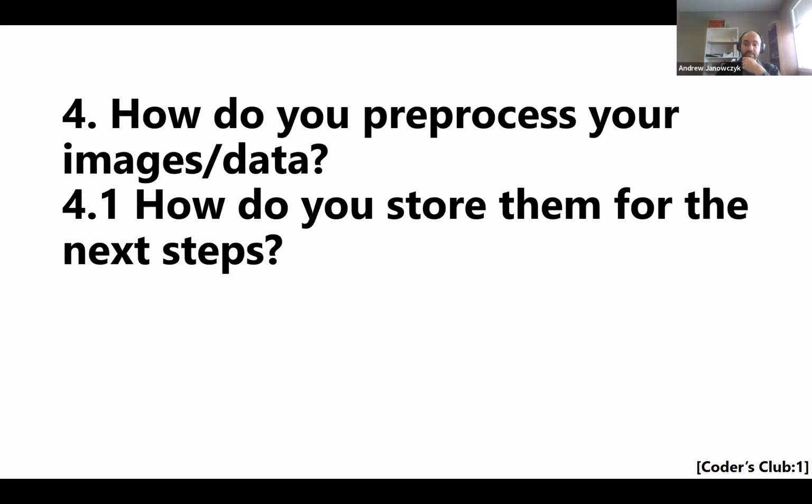One thing I would be extremely careful about doing, that some folks have done in the past, is to try and save individual patches as individual images. And one of the reasons for that is you end up paying a very high storage cost for that. First of all, in just trying to access the directory, searching through all the inodes of those particular files. But as well, the challenge is that, let's say you have a 32 by 32 by 3 patch. The minimum size that hard disks nowadays will save is 4 kilobytes, right? That's just the inbuilt block size of that hard disk.